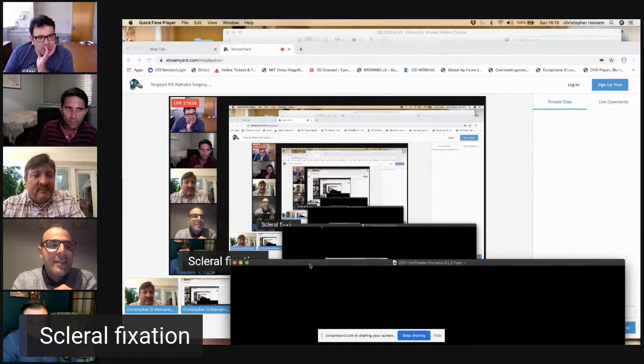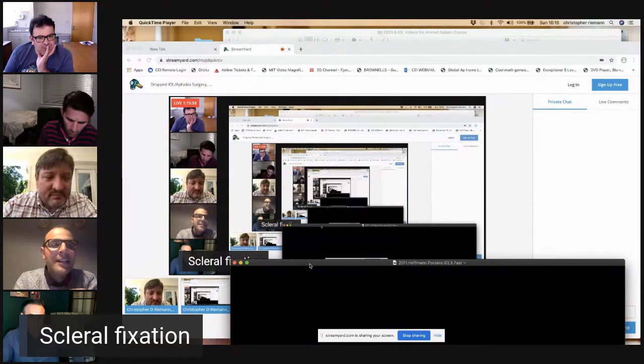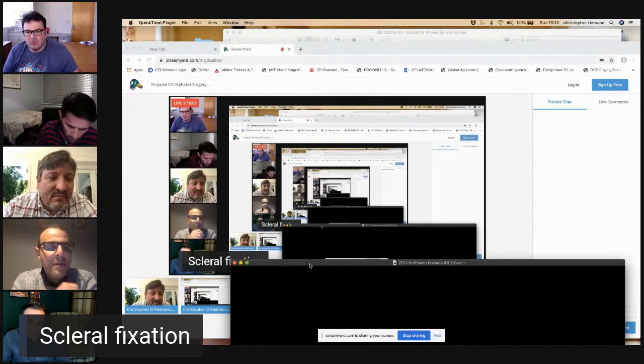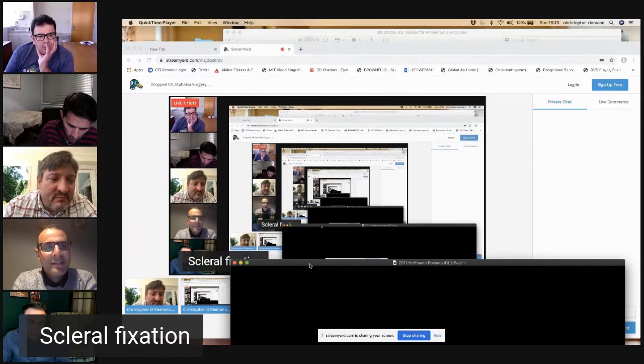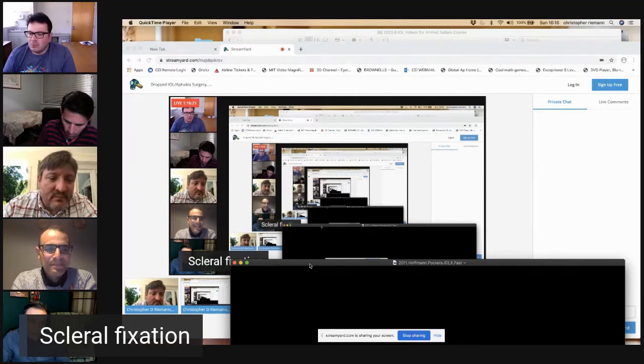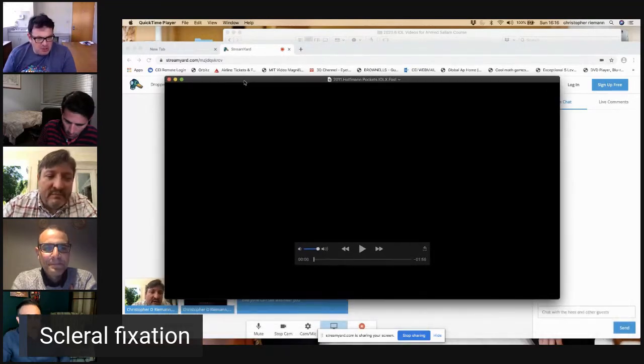You can adjust it a little bit if you find the lens is slightly decentered. So you can pull a little bit one of the haptics. And I tend to do at least 2 millimeter from the limbus. I know some people do 1.5 millimeter, but I feel at least 2 millimeters is good enough to avoid any pupillary touch. But again, on the long term, there's always a concern with distance. Yeah. No doubt about it.